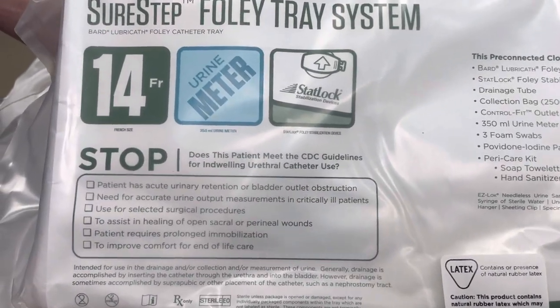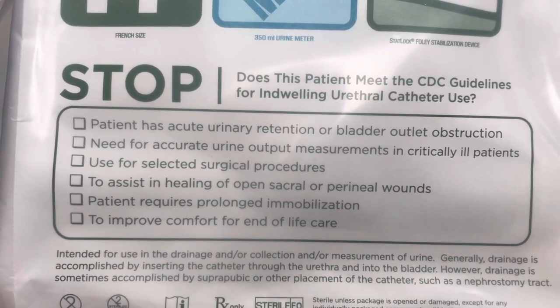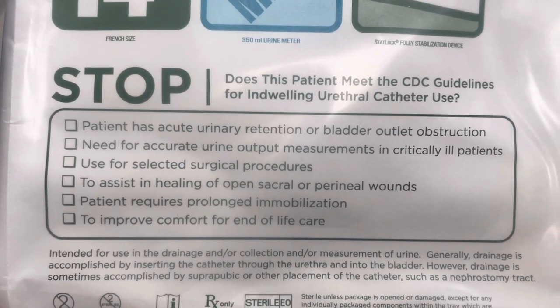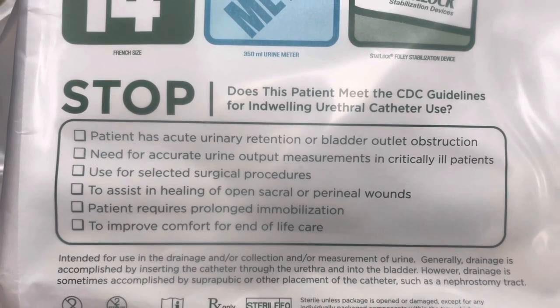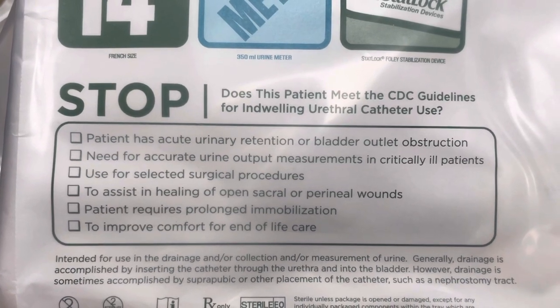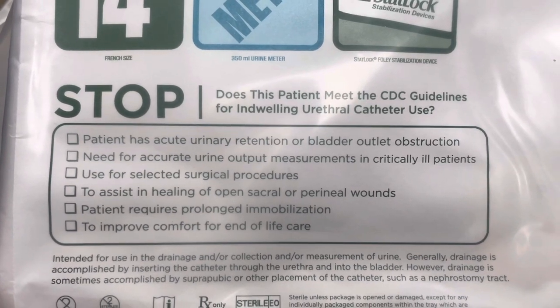When we talk about Foleys or indwelling catheters, we want to make sure that if at all possible we avoid putting them in, because that's the best way to protect our patient. There is a list of reasons that are acceptable for insertion of a Foley in compliance with our policy here at Christ's Mother Frances. For instance, having a patient who needs accurate I's and O's but could possibly still use a bedpan or get up to use a bathroom — that patient would not be a candidate for having an indwelling catheter.